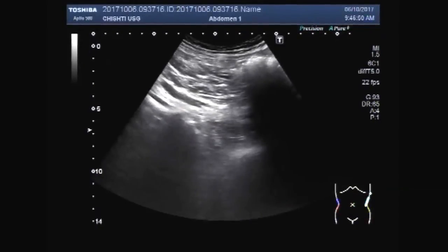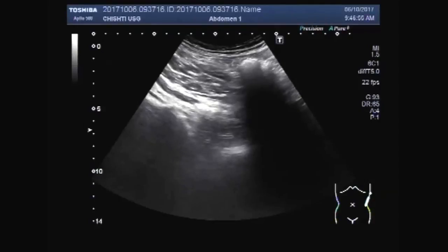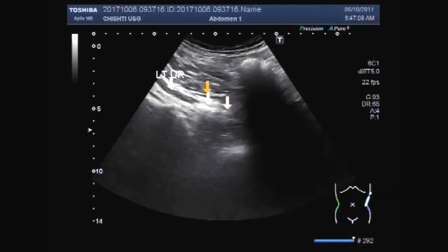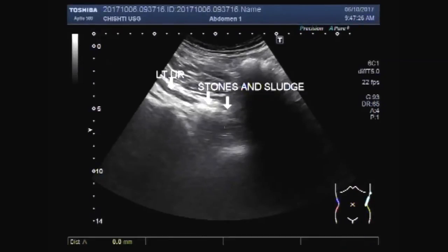Here you can see the stones and sludge in the ureter, including the stone and sludge in the middle portion of the ureter. This dilated area measures about 33.9 millimeters.